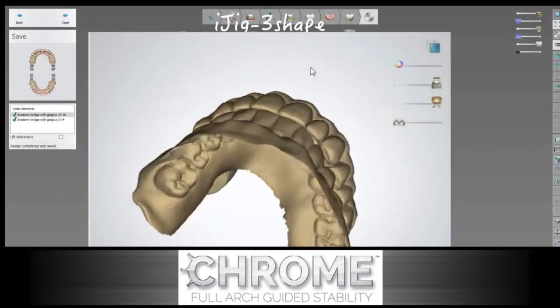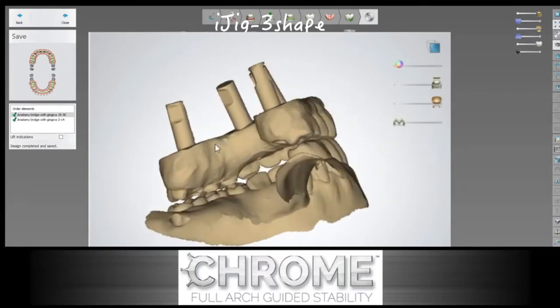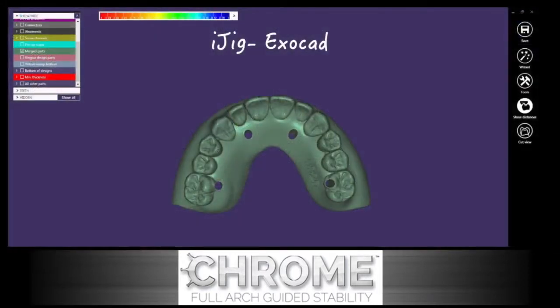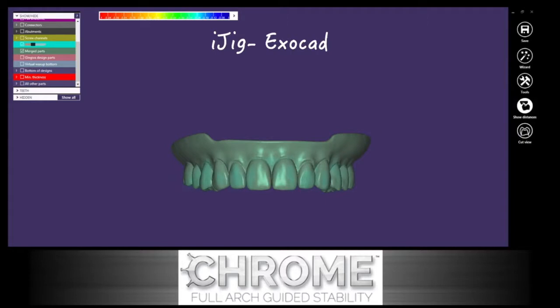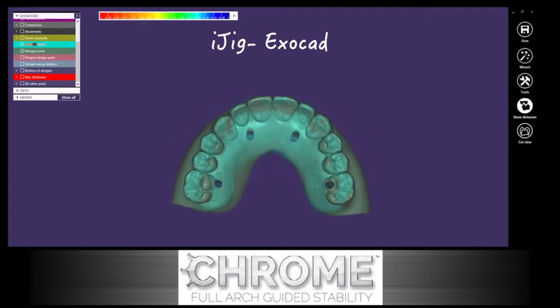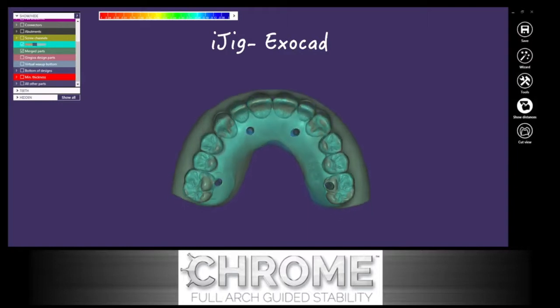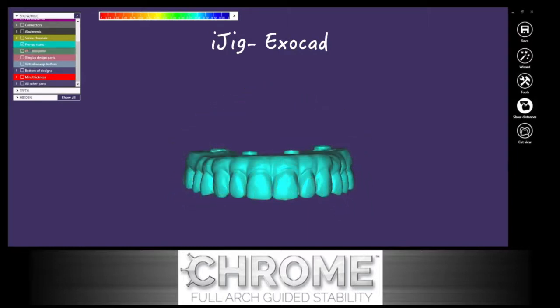Once this is on the laboratory's computer, the technician can take over, complete the design process, and create a virtual model — whether in 3Shape or exocad. Here you can see an exocad version with the iJIG information superimposed over the new design for the prosthesis. This allows for excellent communication between the temporary prosthesis and the final prosthesis.